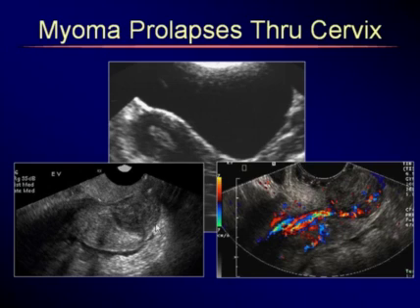Now you could say, well, why do you have to do transvaginal sonography if the clinician can see this from a pelvic exam? Well, you certainly want to know what else is going on in this patient. And sometimes lately we find that our emergency rooms are just sending patients to us for whatever reason, that they come without having a pelvic exam prior to the ultrasound.